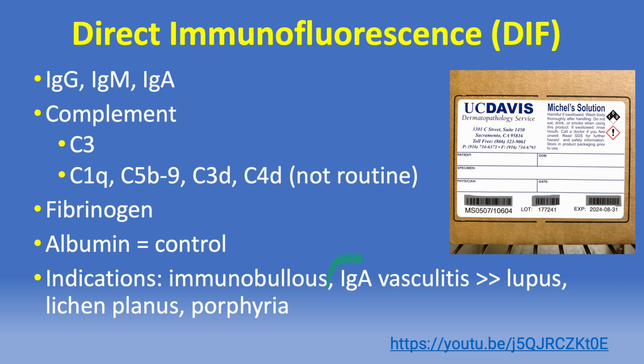And this is essential to establish a diagnosis of IgA vasculitis, but the DIF testing can support a diagnosis of vasculitis when other means are insufficient. So for example, if the routine biopsy was non-diagnostic, having a positive DIF could support a diagnosis of vasculitis.